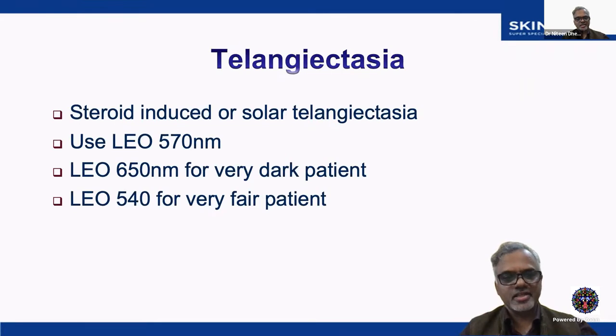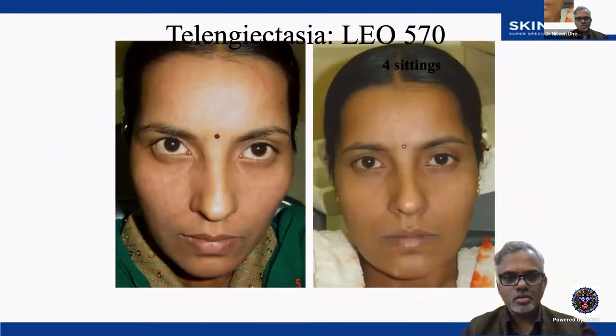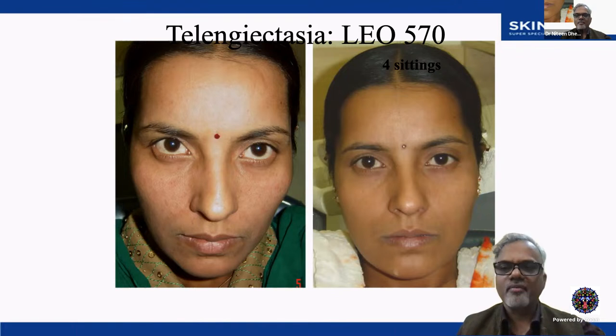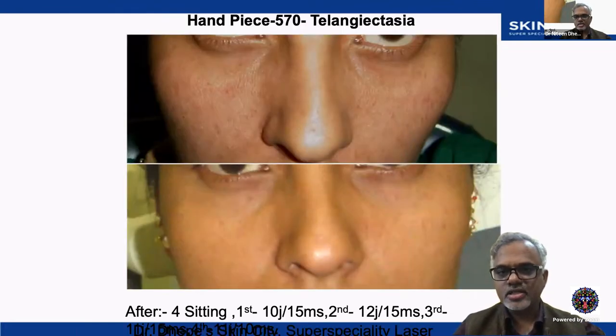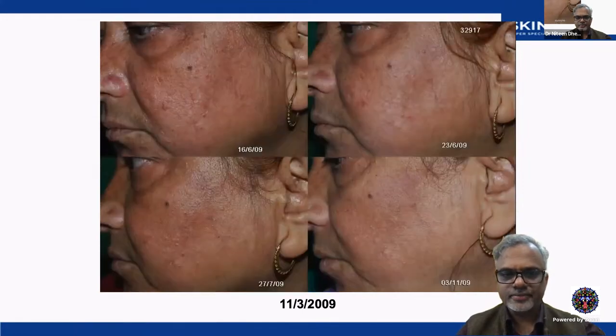Telangiectasia, again: in Western countries they use the pulse dye and the Nd:YAG laser, but here we use the IPL, a vascular IPL with double filter, 500 to 600 nanometer or 550 to 600 nanometer. It is useful in telangiectasia. It just blocks the capillaries without affecting or burning the skin.